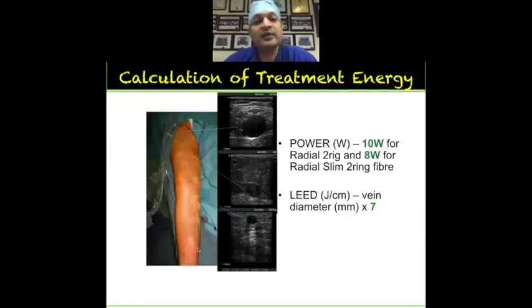Then there is some concept of calculation of treatment energy.